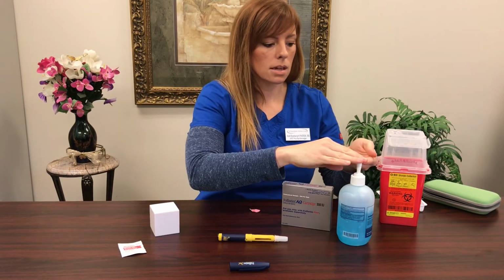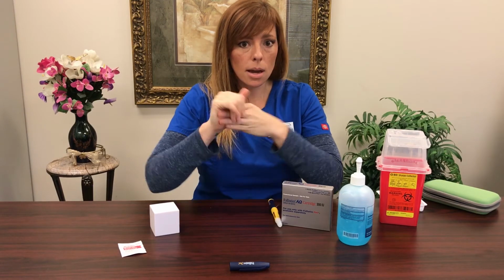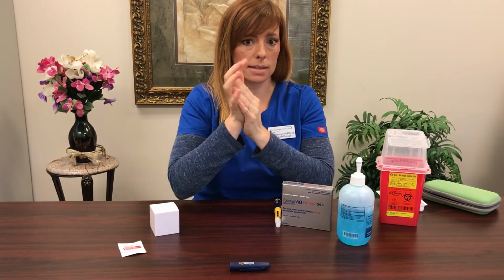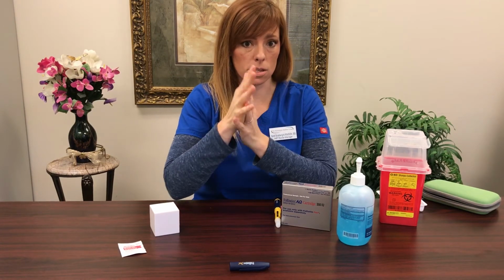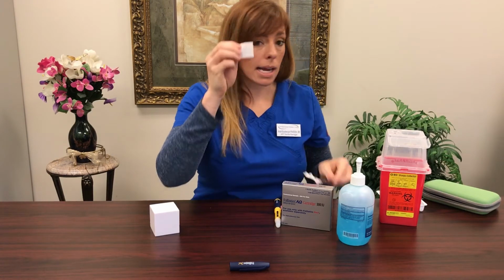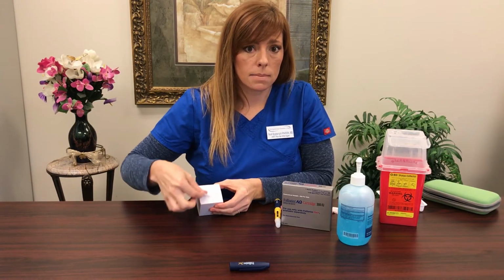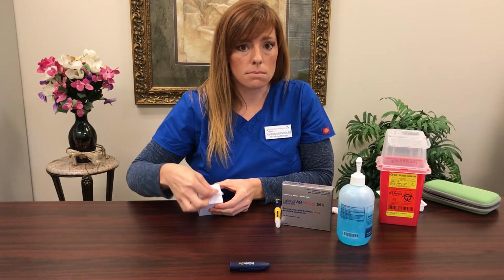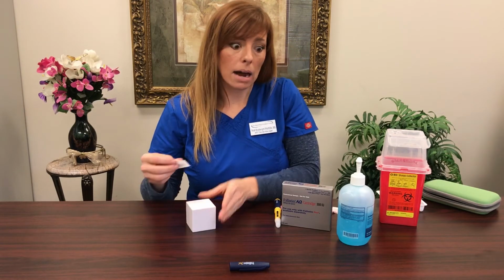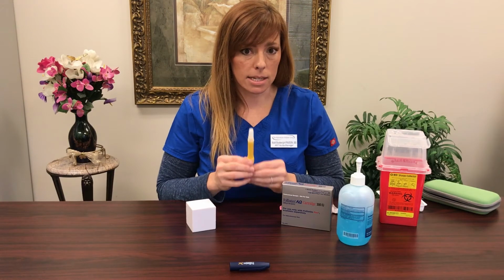Let's wash our hands. Warm water and soap is actually better. But if you're not in a place that has that, use your alcohol, rubbing your hands together until it dries. That is the best way to do this. Then I want you to prep your skin. We're going to take our alcohol swab and rub our skin, and this is the belly skin that we're going to be doing our injection in. And remember, you can move from site to site. In that belly fat, we want to stay about an inch away from your belly button. Let this air dry. We're ready to inject.